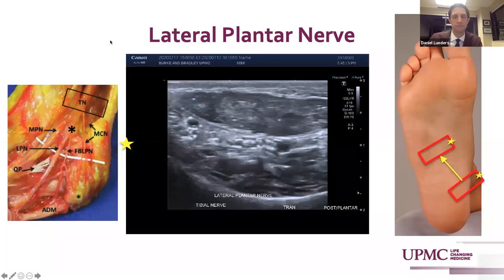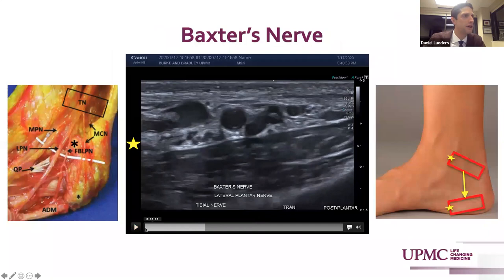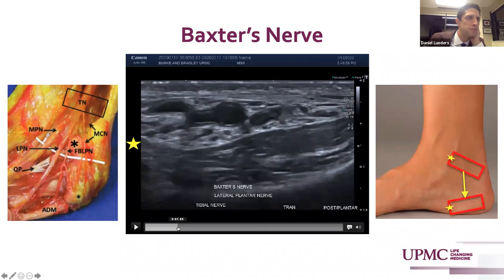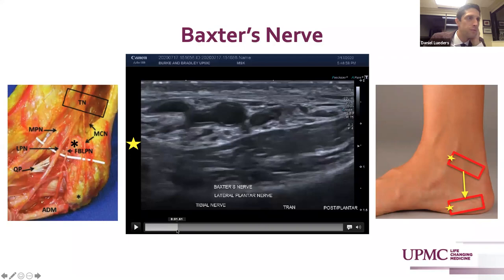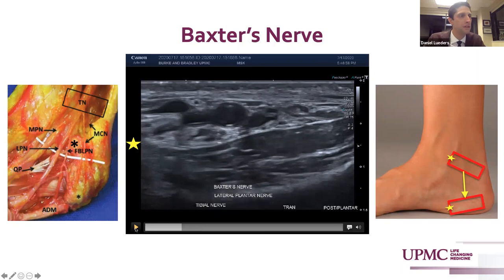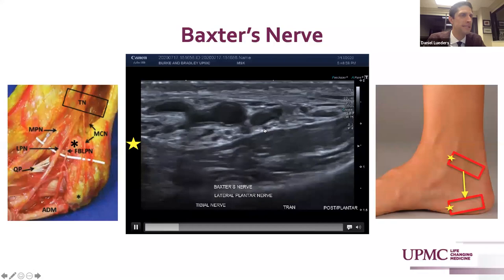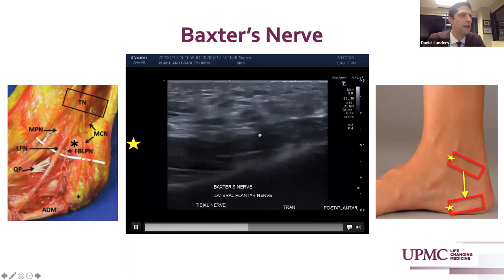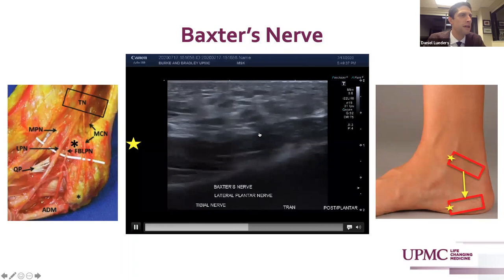Here we see the lateral plantar nerve and the medial plantar nerve. Almost immediately after these separate, we're going to see a fascicle move posteriorly off of that. Here we have the lateral plantar nerve proper, and as we course inferiorly and posteriorly, we see a distinct fascicle come off of that, which is Baxter's nerve, or the first branch of lateral plantar nerve, moving posteriorly. That fascicle breaks off from the lateral plantar nerve proper and courses inferiorly and distinctly dives down near the central band of the plantar fascia.